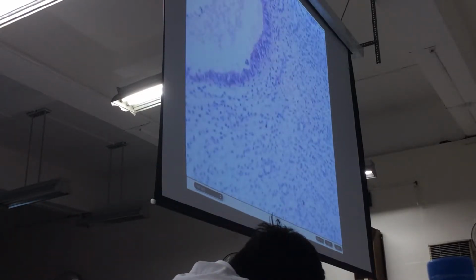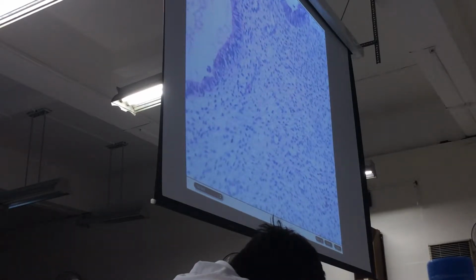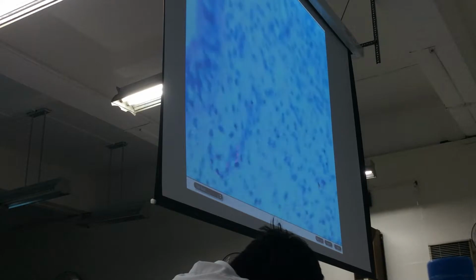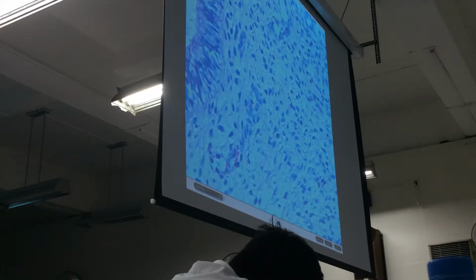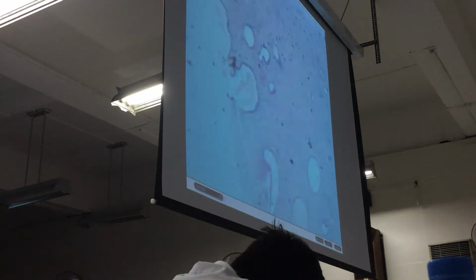Likewise, the stroma of the endometrium becomes fibrous, not the usual embryonal type of stroma. Overall, the endometrium becomes thinned out. This is what you call senile cystic atrophy of the endometrium. Okay?